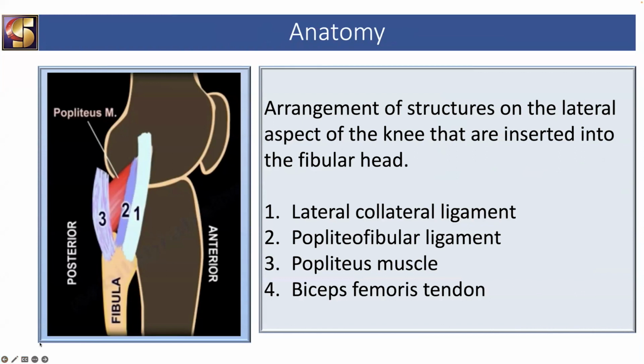So in this section, we first see the iliotibial band, lateral collateral ligament, then the popliteofibular ligament, because all these structures we can evaluate in one go. That becomes very easy rather than doing just individual popliteus tendon analysis. Anyway, we have to see all these structures for evaluation.